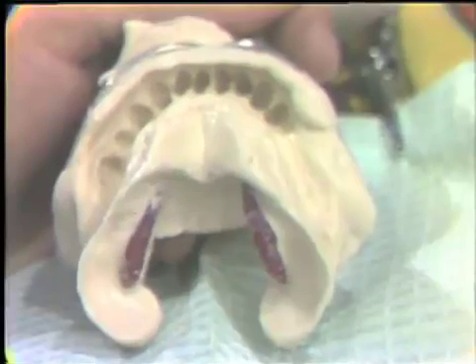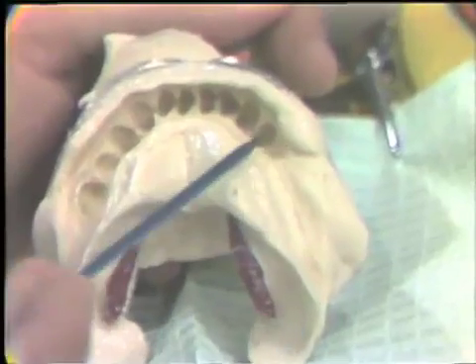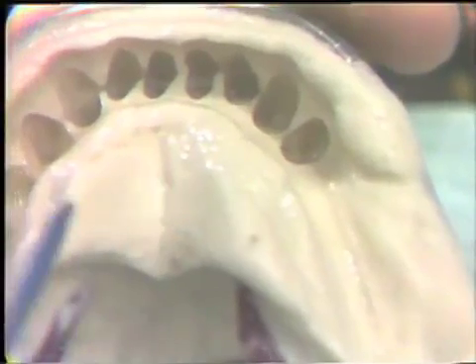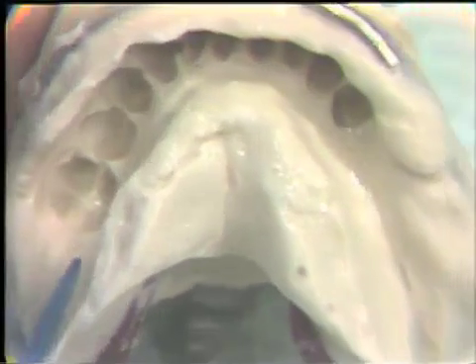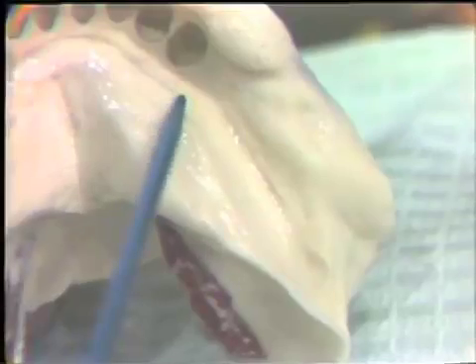The alginate impression should be examined critically before pouring. The areas of primary concern are the abutment teeth — the potential abutment teeth, this bicuspid and the molar on the opposite side — and they should be accurately recorded. The lingual bar area should be accurately recorded, as should the edentulous ridge area and the residual ridge area.